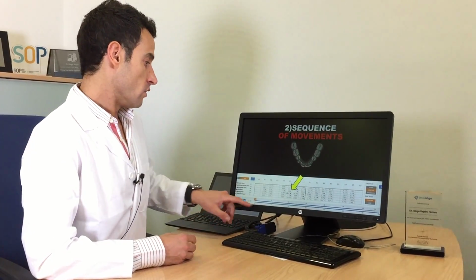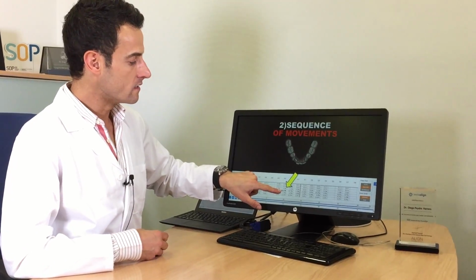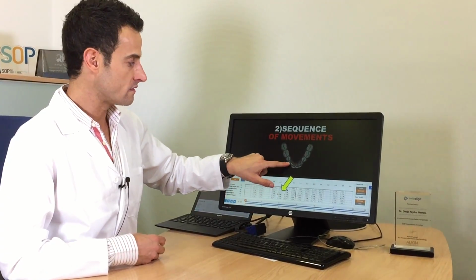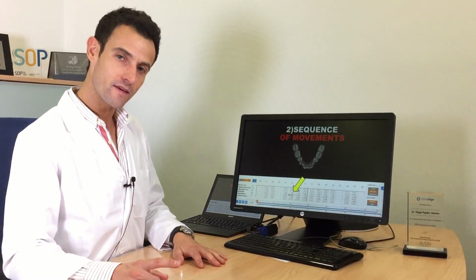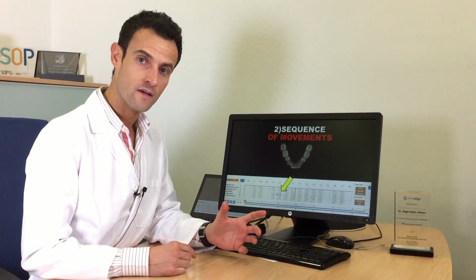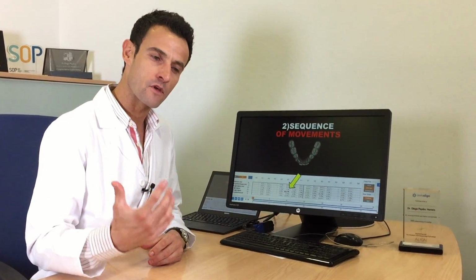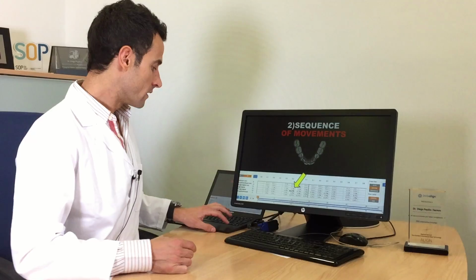Okay, look here. The system tells me that I have to derotate this canine 62 degrees. 62 degrees. Can you imagine derotating 62 degrees with braces or with Invisalign? So you have to think, okay, I have a really complex derotation. How can I do it?